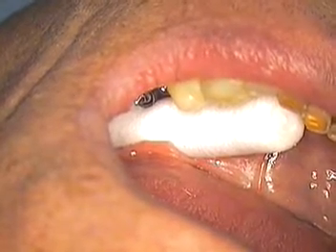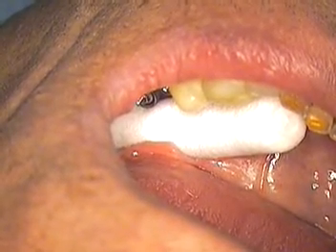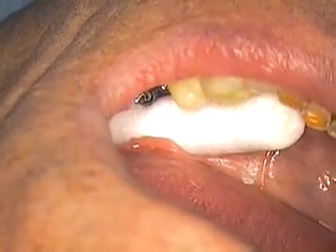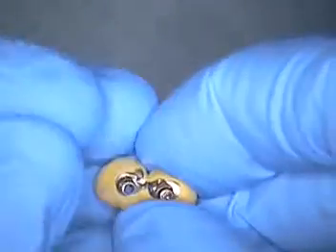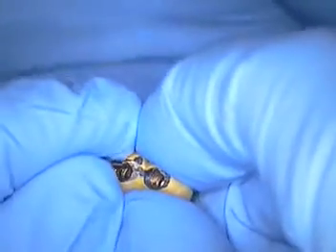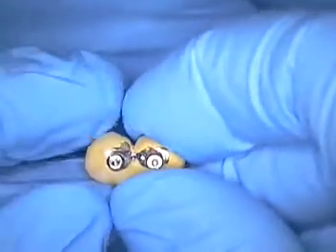Prosthetic screws are so small. Well, you drop them on the floor and good luck trying to find them. So here they are. And we'll just put this one and it goes into 19. So there they are.